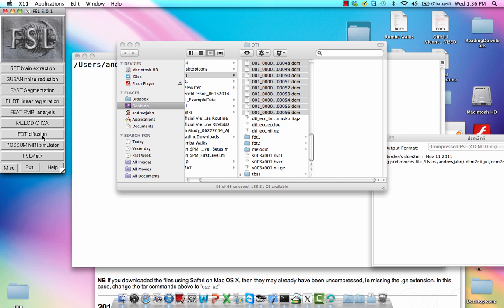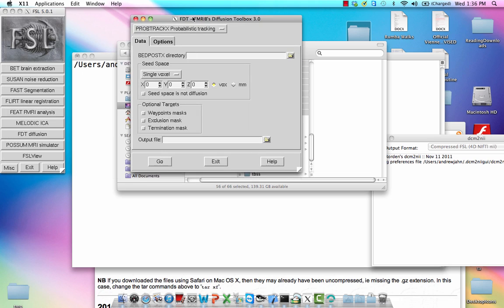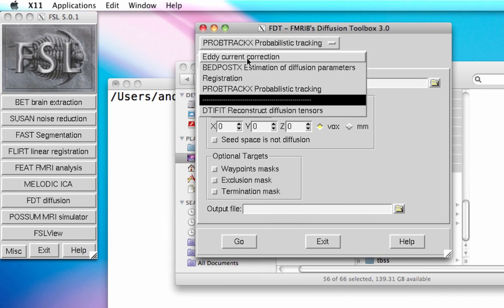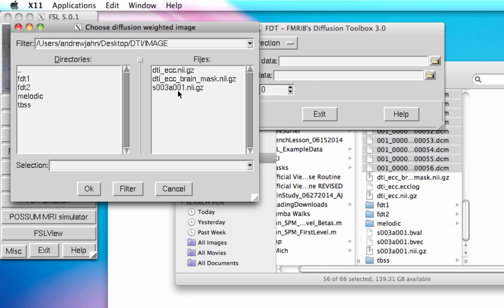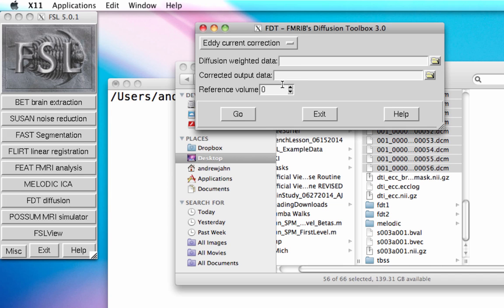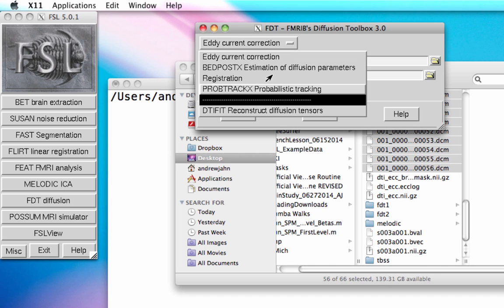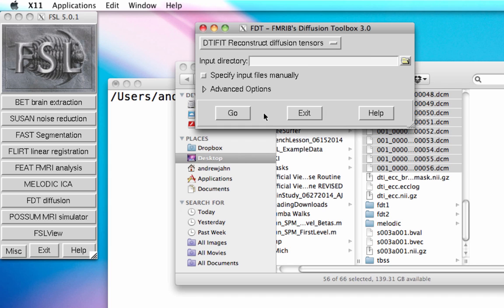This is just a very brief overview to get your feet wet with DTI data. The first thing you would do is something very similar to motion correction, called eddy current correction — you just upload your diffusion weighted data, give it an output and a reference volume, and hit go. It takes a long time. After that, the next step is DTI fit, which reconstructs the diffusion tensors, giving us a sense of where the predominant direction of diffusion is going along these different fibers.